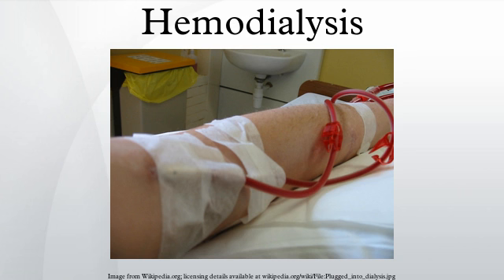Daily hemodialysis. Daily hemodialysis is typically used by those patients who do their own dialysis at home. It is less stressful but does require more frequent access. This is simple with catheters, but more problematic with fistulas or grafts. The buttonhole technique can be used for fistulas requiring frequent access. Daily hemodialysis is usually done for 2 hours 6 days a week.